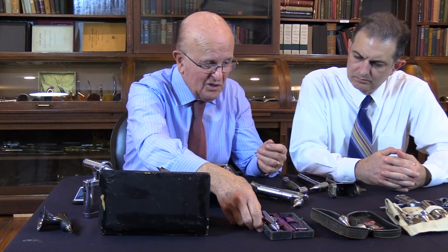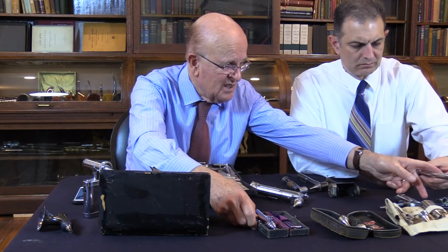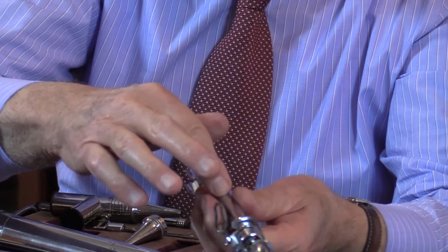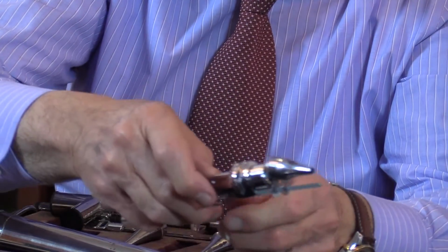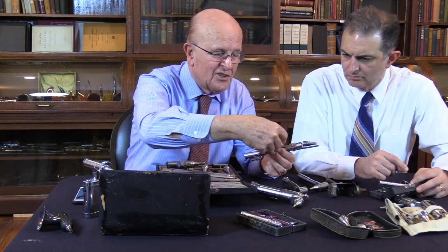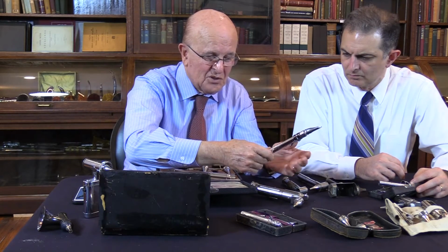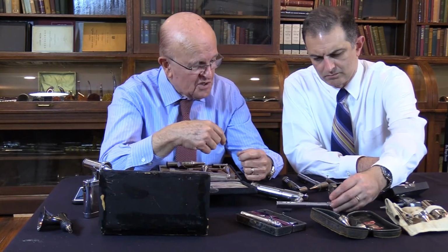Another interesting scope, if I can get this here. I think this is called the Kai-Fu scope, where there's the battery here, the light is here, and the ear speculum. And this is how it comes. It comes in a box, and then you put it together. So it's one of these that you can slip in your pocket because of the small size. People were excited about this kind of change.